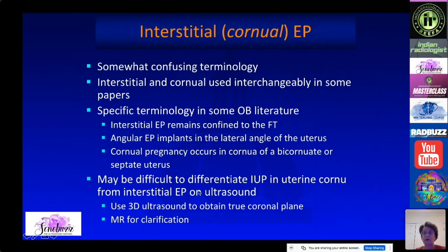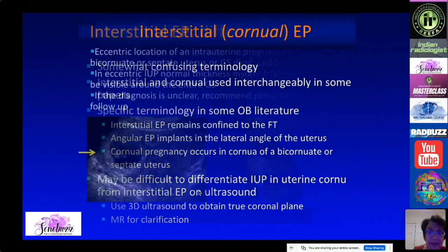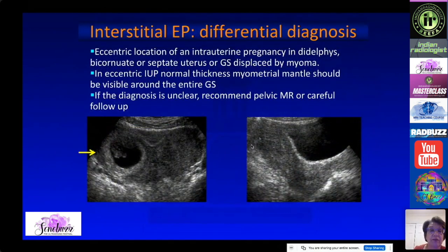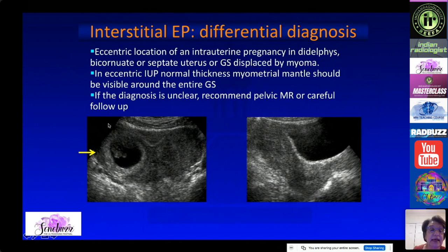It can be difficult to differentiate these entities, and 3D ultrasound may be helpful because you can obtain a true coronal plane. Here is a true cornual pregnancy — it is eccentric because it is in one horn of a bicornuate uterus, but unlike the interstitial cases, you can see myometrium around the gestational sac. If the diagnosis is unclear, careful follow-up or pelvic MRI can be obtained.